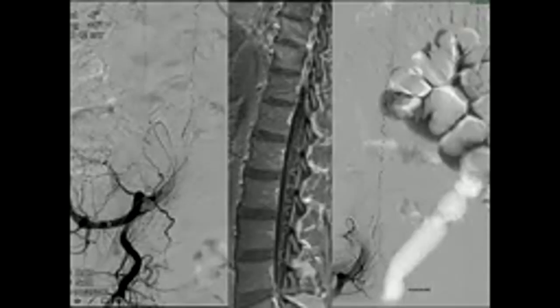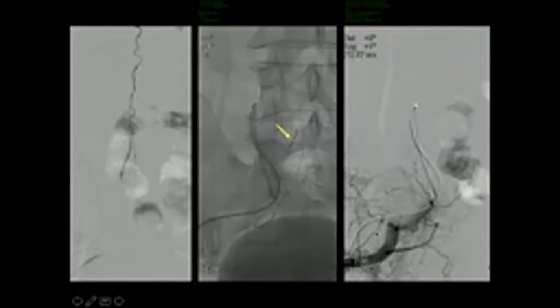Typical dural type 1 fistula. This is again from the sacral one, internal iliac one. You are able to reach there. The important thing technically, you need to take the proximal portion of the vein. If you don't take the proximal portion of the vein, the collaterals are very rich and then it will recur. That is a simple rule for endovascular or open surgical technique.